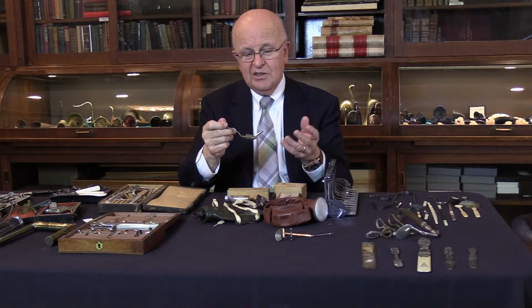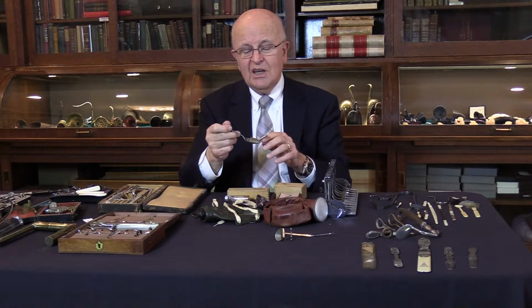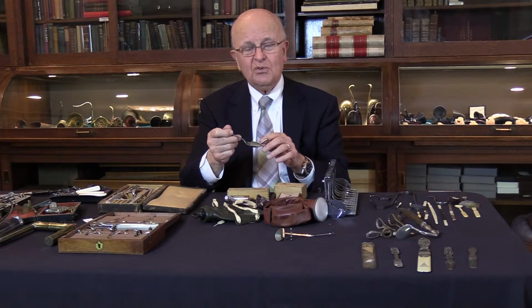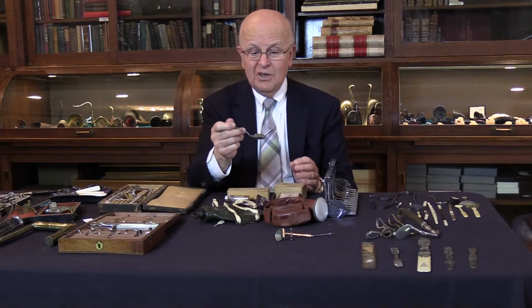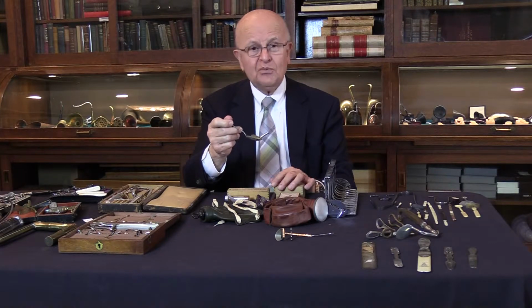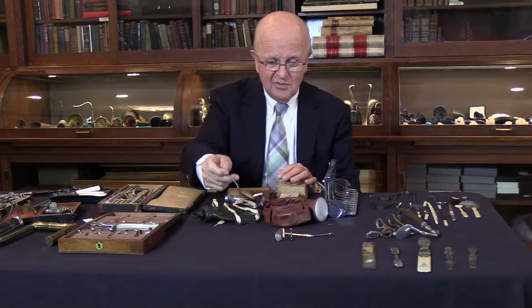And I read somewhere that frequently they used to put hot oil that could burn the eardrum. So this could have been a very drastic and painful way of doing it.